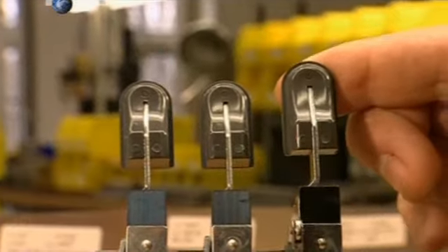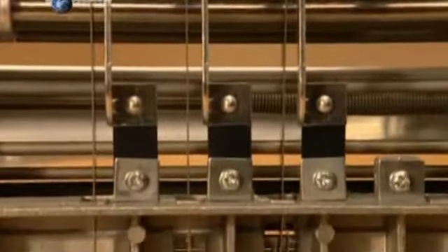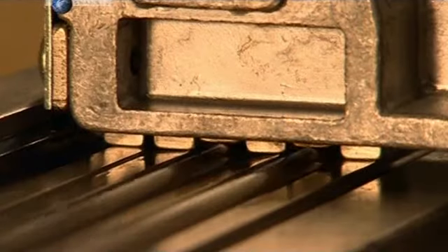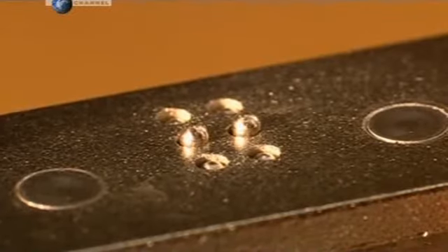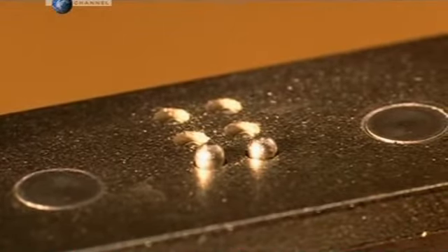Here is how it all works. When a key is pressed, it triggers the cam lever to turn the cam rod and pushes up the stylus. The stylus strikes the paper against the die, yet to be installed, and produces a raised dot.